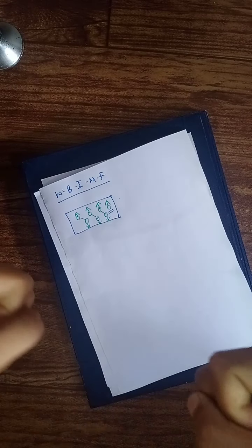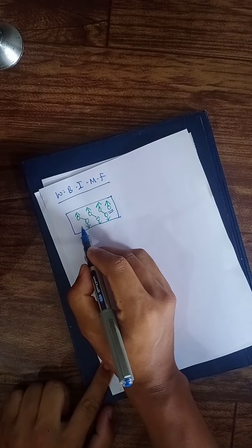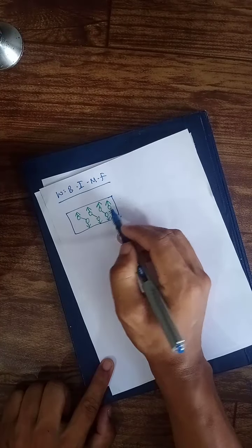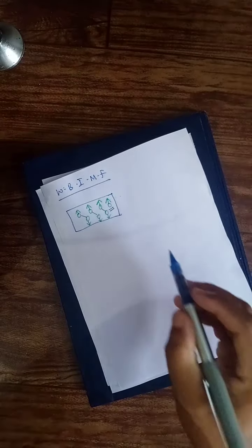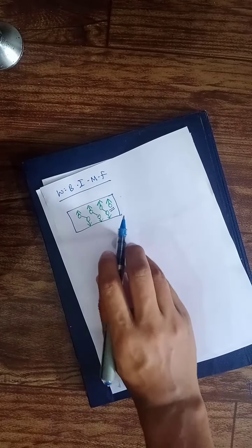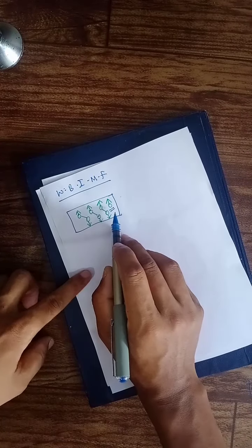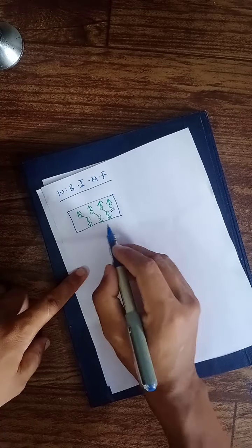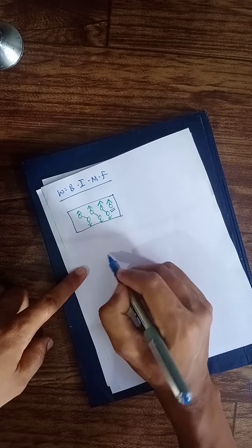Parallel and anti-parallel, they're gonna pull each other and it will get demagnetized. So which one is remaining? Only the single one, right? So this one will remain, because he didn't get anyone to fight. So now what will happen is this.